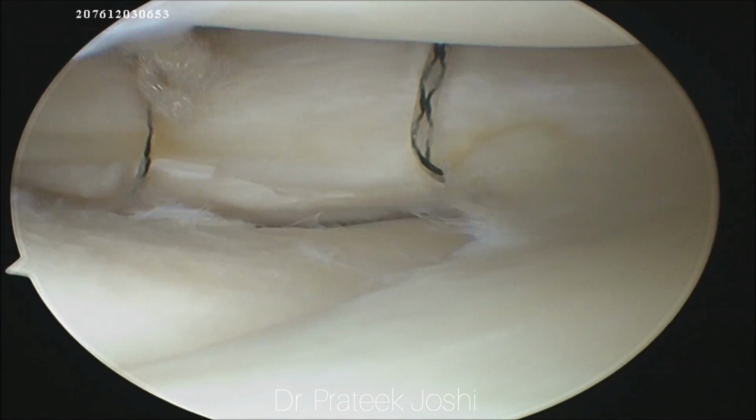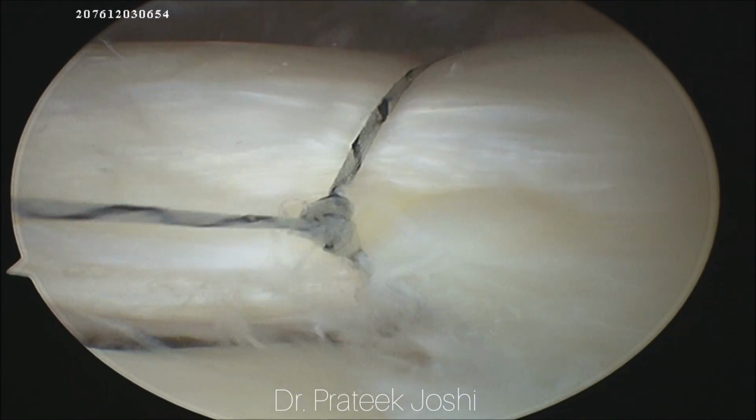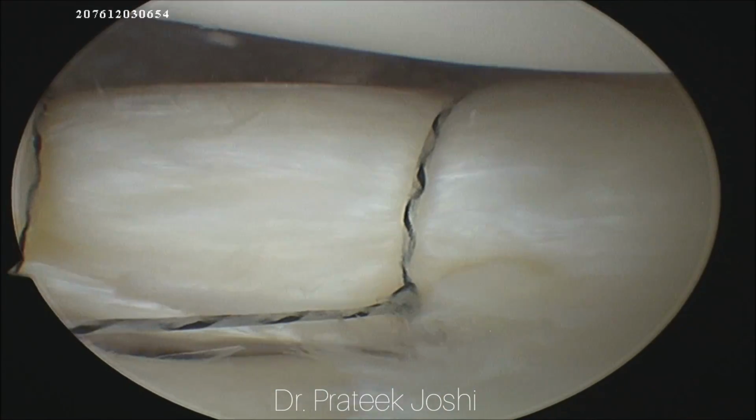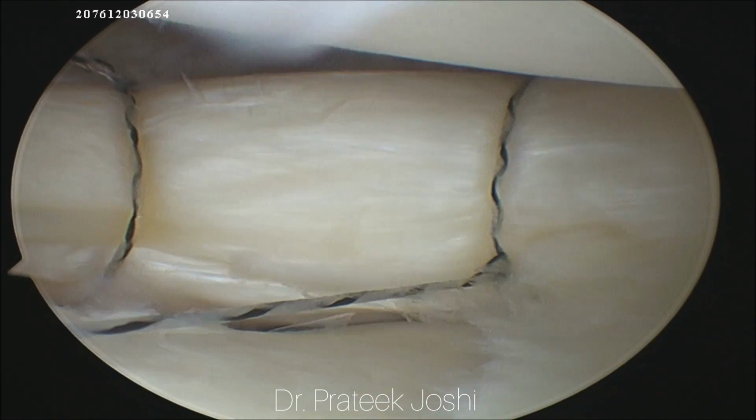So now I am going to gently pull the thread in order to tighten the knot, which will complete our second suture repair of the torn lateral meniscus by all inside device.